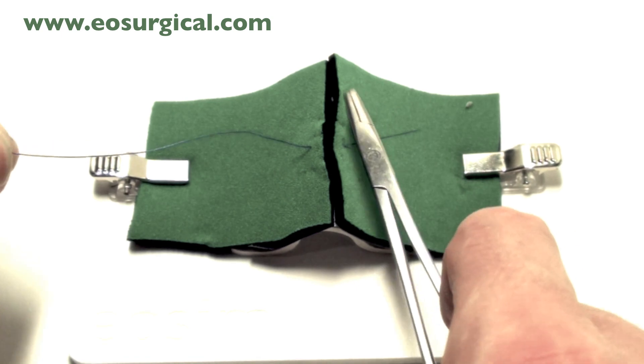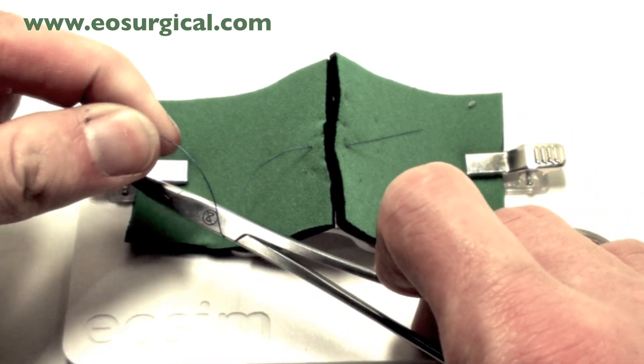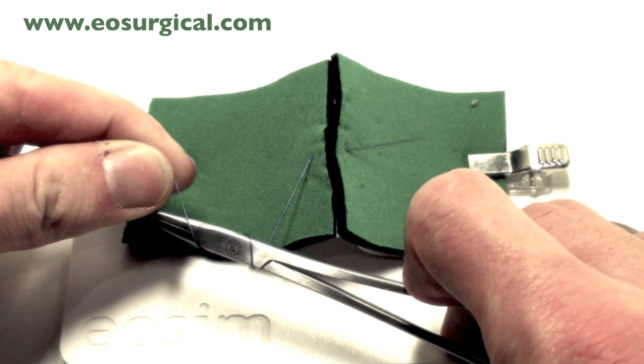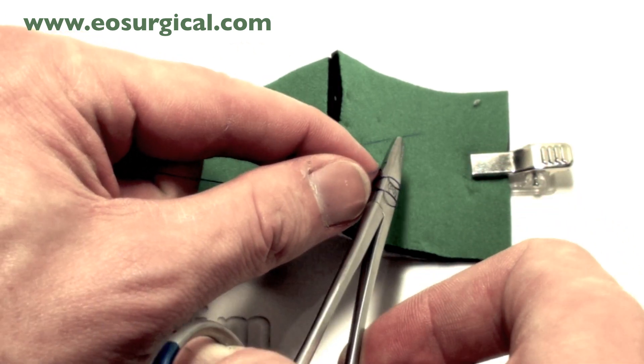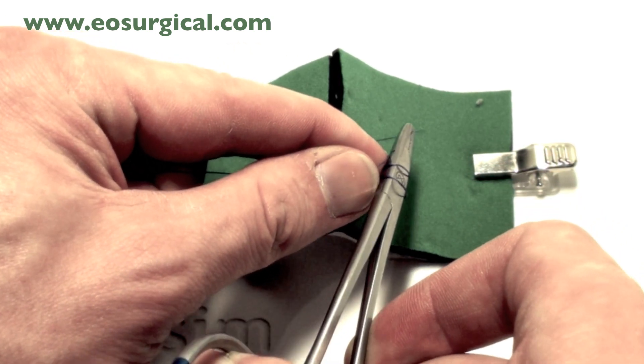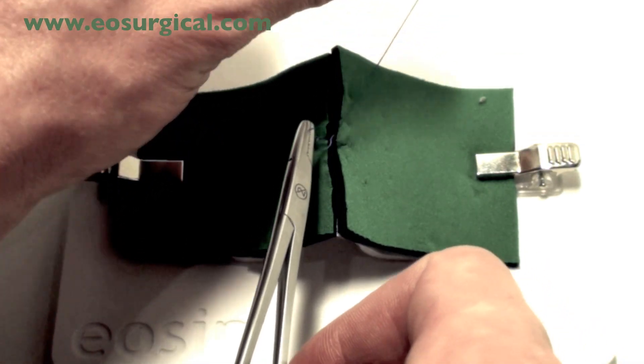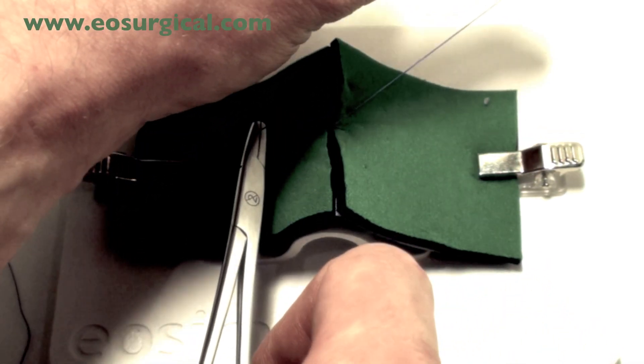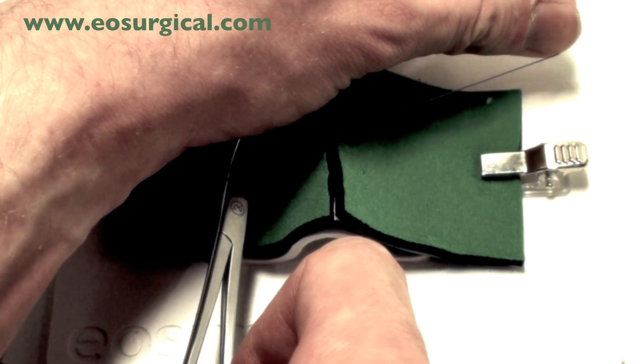Now start at the short end and bring the needle holder up and wrap the longer end of the suture around it twice. This will be your first throw. It's important that your arms cross at this point to ensure that you've got a flat knot.